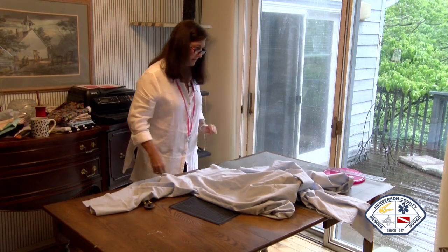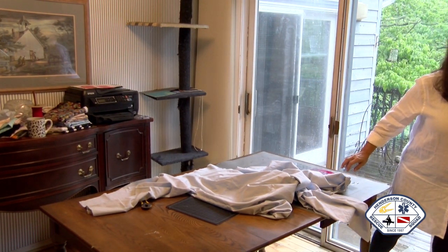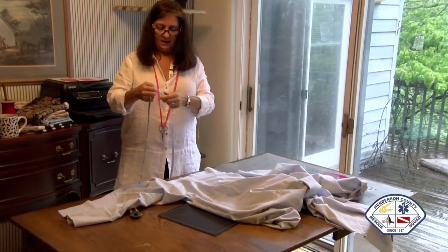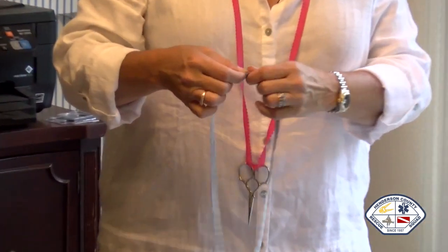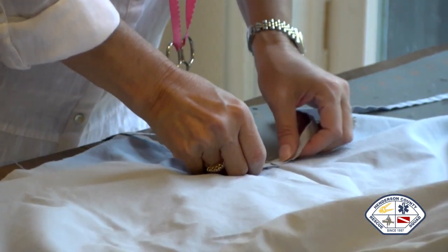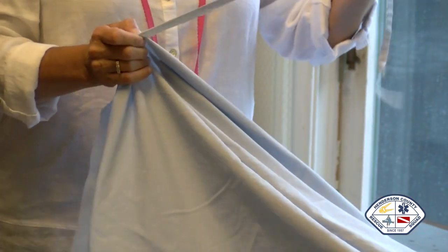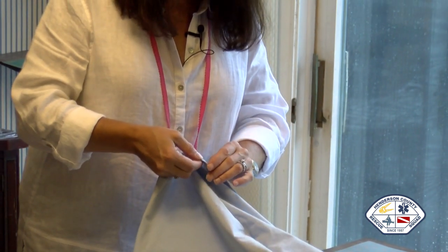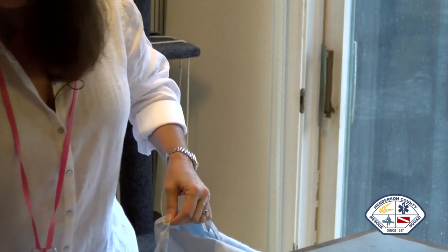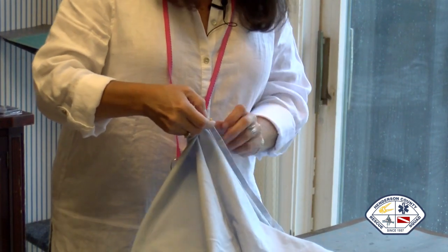Okay, let's see here. The neck, I used an edge that I cut off, and I marked it in the middle. It wasn't quite long enough, so I sewed it together in the middle and doubled up. What we're going to do here is put your center on the neck, and this is like a bias tape. It's going to fold over and make the edge of the neck more comfortable for whomever is going to wear it, and keep your fabric from fraying when it's washed.